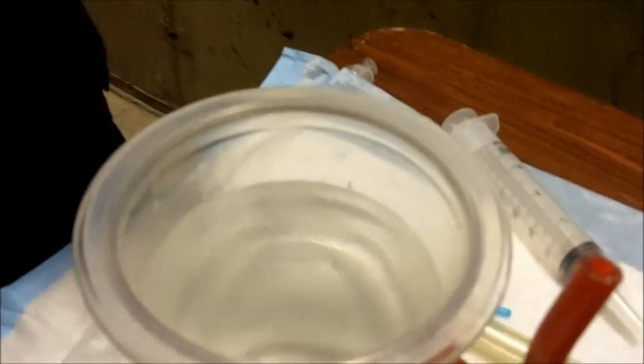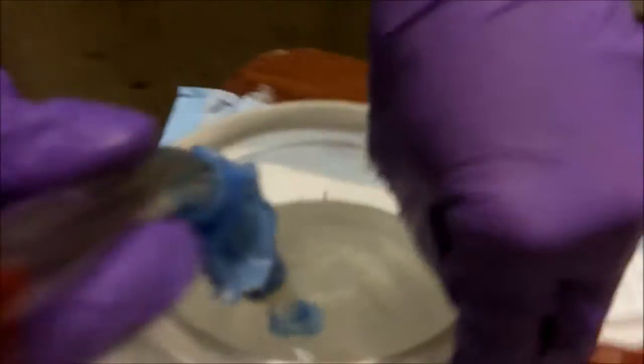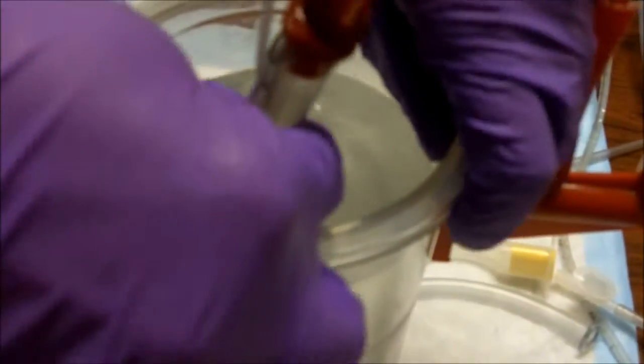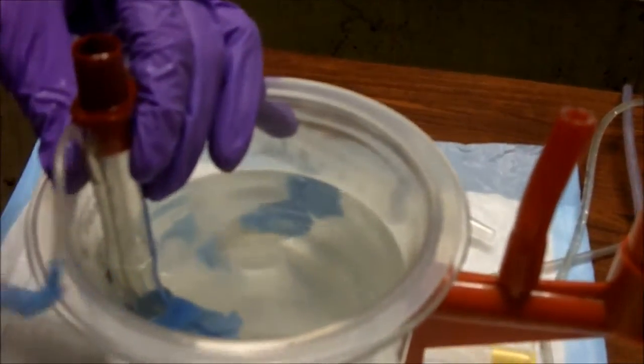Now, we're going to focus down here on our patient. This is a very large opening. Most mouths are not this way, but you will reach in, lift up on the patient's tongue, insert the King airway in the corner of the mouth, much like an OPA, seated down to the level of the teeth, and then rotated to inline of the chin.